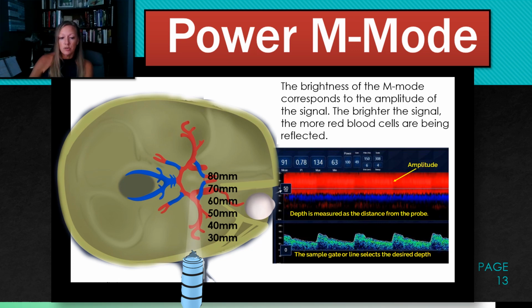This is your middle cerebral artery, and this is the segment of the middle cerebral artery called the M2 segment. As you travel deeper within the base of the brain, from 40 to 50 to 60, this is still your MCA. This is your M1 segment of the MCA. You can see where it's meeting another vessel here. This is your MCA-ACA bifurcation. And then your ACA comes forward, and then that's where the ACOM is in the center connecting your two ACAs.